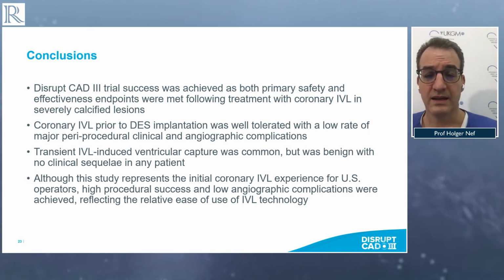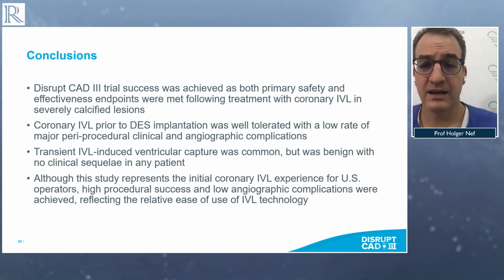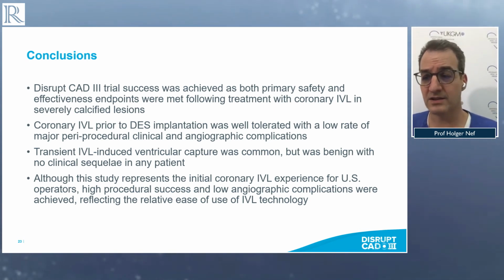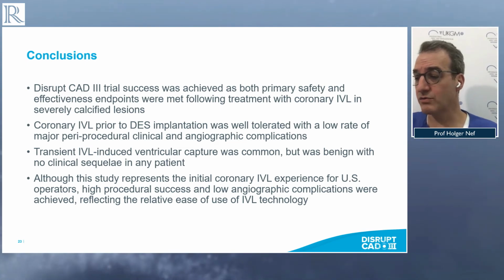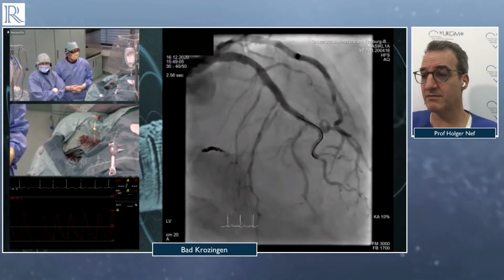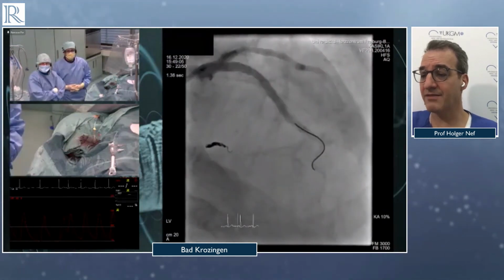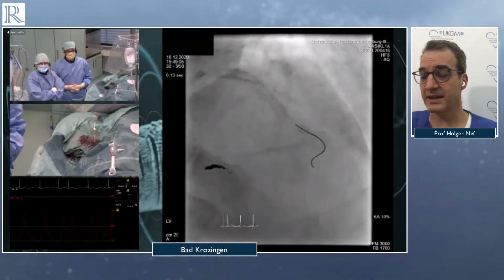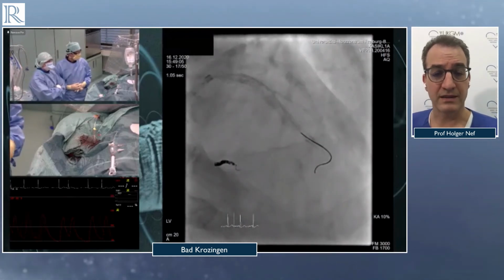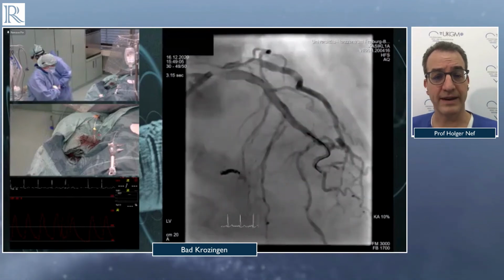So with this, I would like to switch over to Bad Krozingen again and have some final Q&A and closing remarks. And of course, you have been very active in this webinar, and we have also some questions left. And first of all, I would like the operators to show us again the final results.